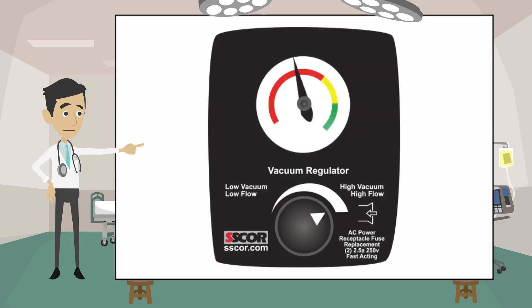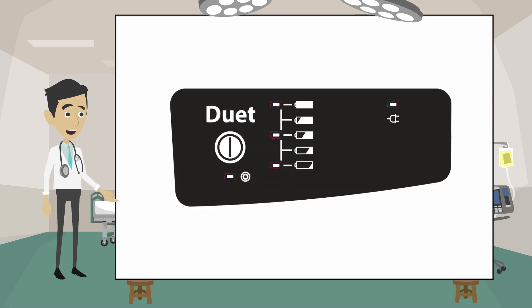A variable flow regulator makes it easy to adjust for adults or pediatrics. The battery display uses LED lights to indicate the battery level. LED lights also indicate when the pump is running and when the pump is charging.